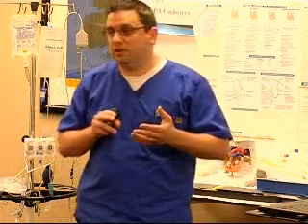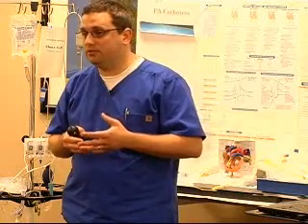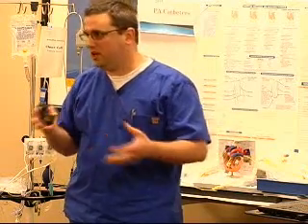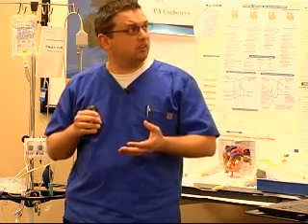One of the first things they're going to want you to do once you've confirmed your position for your PA catheter on insertion is to get a first set of numbers. They're like, waiting, what's my first set of numbers? That's what they want to know, because they want to see what they have that they're working with. So, stroke volume times heart rate, simple.